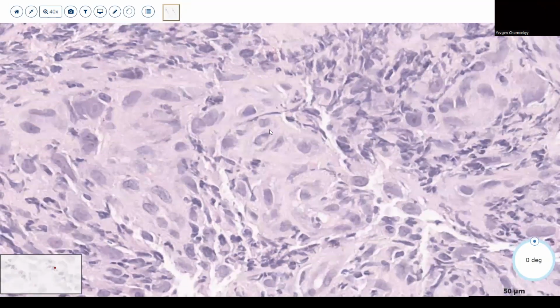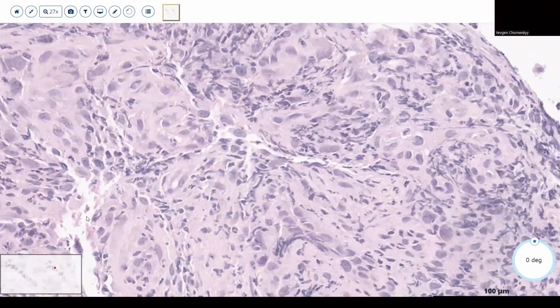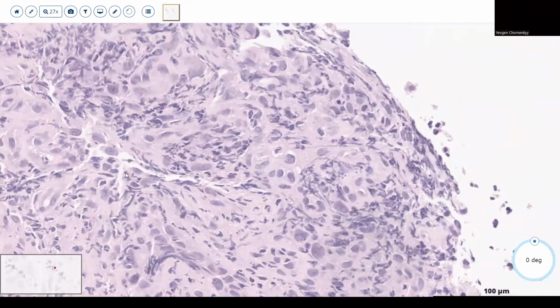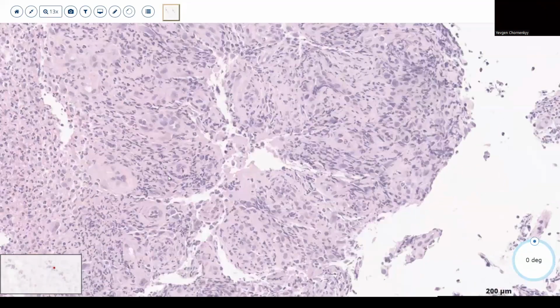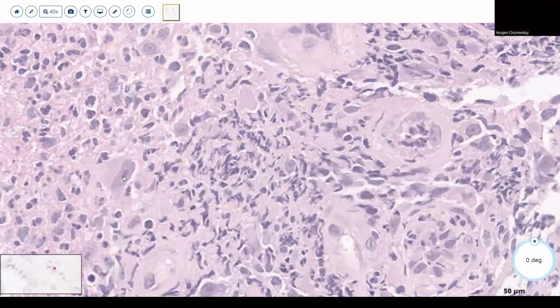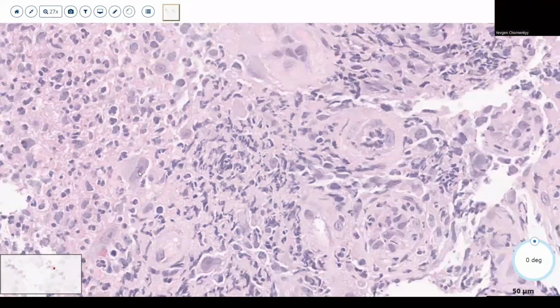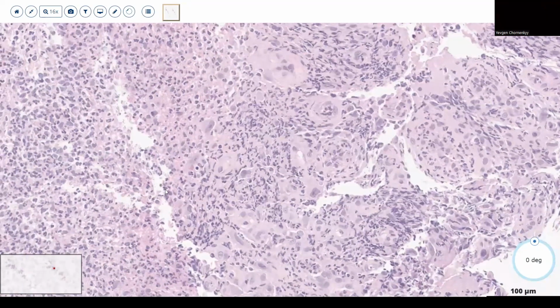I can't see one, but I have a picture of it that I saved on the PowerPoint, which is super duper characteristic. But you're seeing these really big cells. And then, okay, oh my God, that's the one I was looking for. And textbooks will say CMV is at the bottom of the ulcer, and HSV is on the sides of the ulcer, or vice versa.